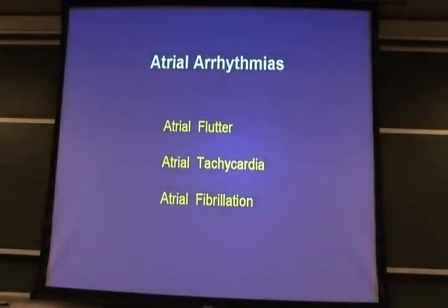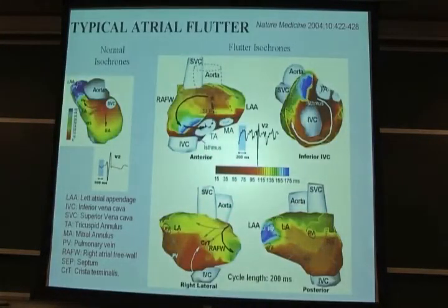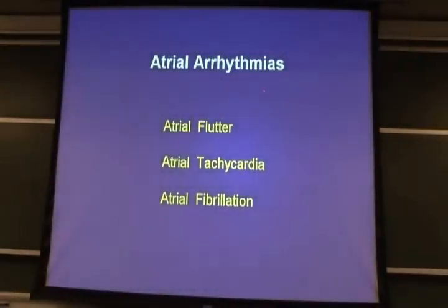So what I wanted to do is show examples of electrocardiographic imaging. And I mostly wanted to focus on recent data, things that I haven't shown in the past. Although it's a mixture, some of them are older, some of them are newer, but I tried to include some new data that we really have not yet published. And this is data published, but I first wanted to show examples of atrial arrhythmias. I'm going in the order of the cardiac impulse, from the atria to the ventricle.